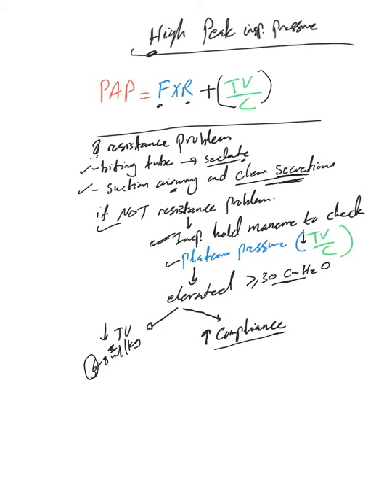We talked about increasing compliance in detail in previous videos; increasing compliance means increasing the stretchability of the alveoli, right? So if there is ARDS, pulmonary edema, obesity, or pregnancy, we need to treat.